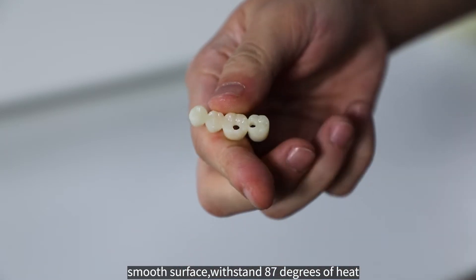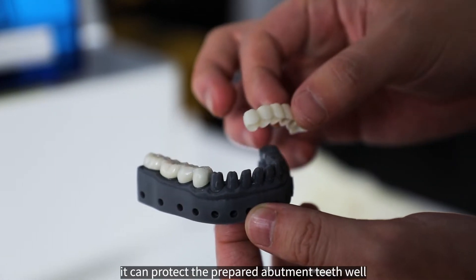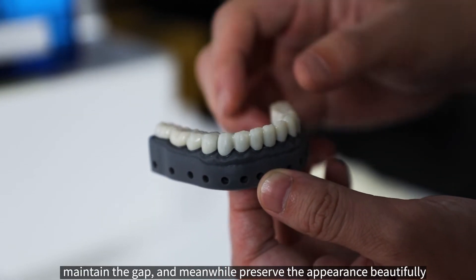The resin can withstand 87 degrees of heat. As a temporary crown used in the pre-implant period, it can protect the prepared abutment teeth well, maintain the gap, and meanwhile preserve the appearance beautifully.